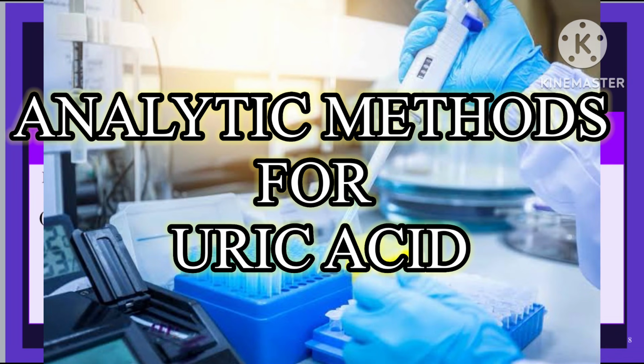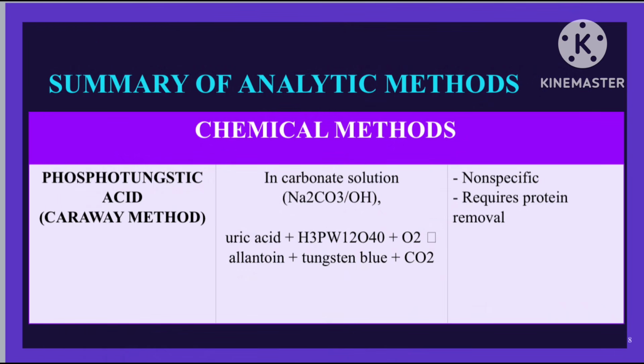Let's now proceed to the summary of analytic methods in order for us to determine uric acid in the laboratory. We have already established, class, that most other mammals have the ability to catabolize purines to allantoin. And remember, this allantoin is very important because this is the more water-soluble end product.